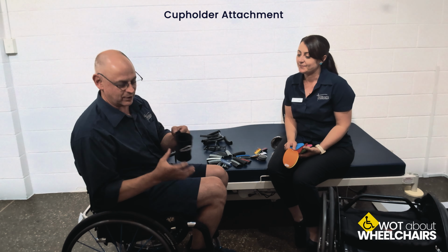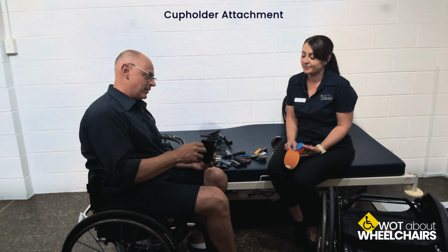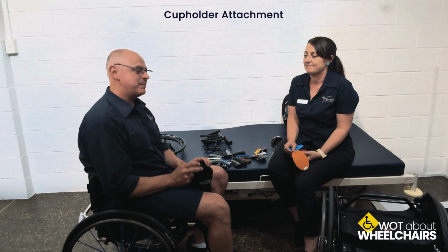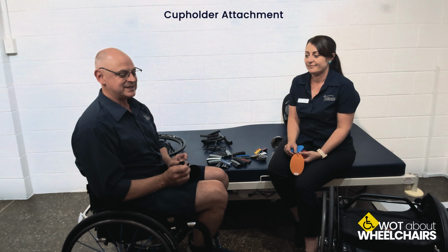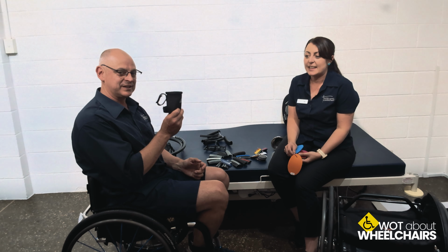And last of all, the all-important cup holder can be attached as well. So what we were told by the representative here is, no matter what you want on your chair, we need to get the chair right for you first, and then the add-ons can come.